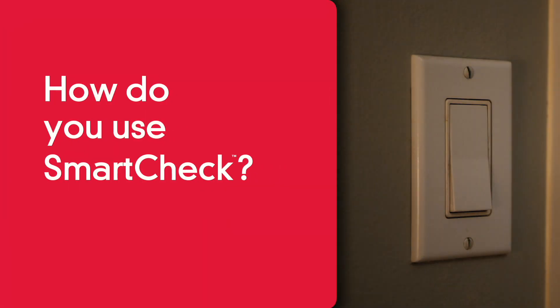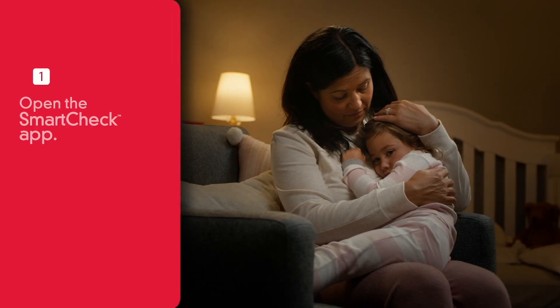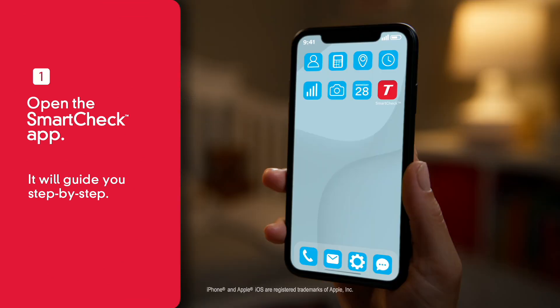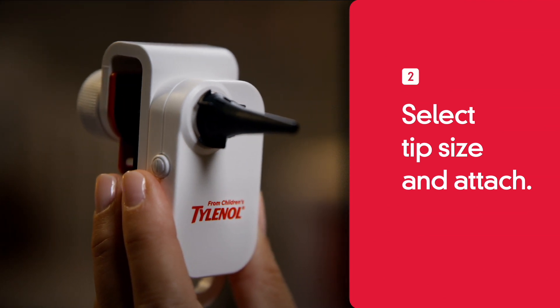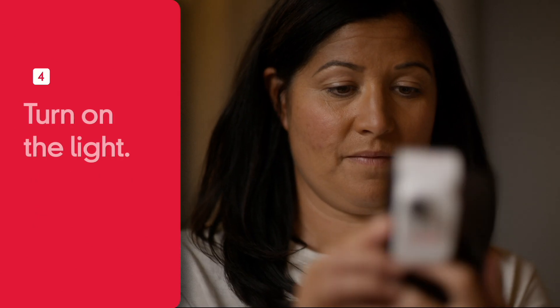How do you use SmartCheck? It's simple. First, open the SmartCheck app. It'll guide you step by step. Next, select the tip size and attach. Then slide the device onto your phone, tighten, and turn on the light.